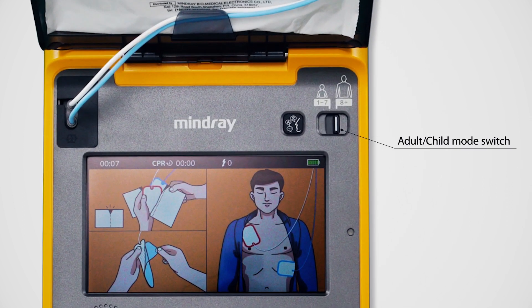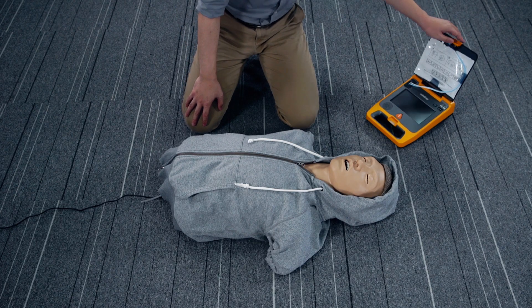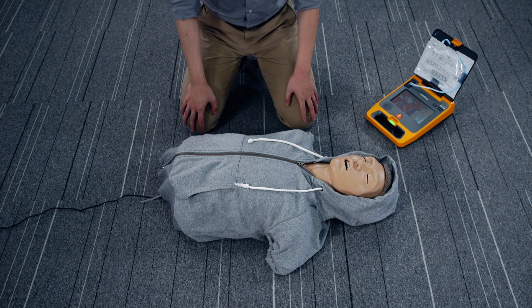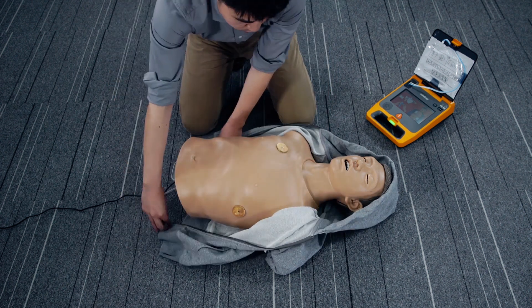Adult Mode English. Powered on. Stay calm. Follow the instructions. Remove clothing from patient's chest. Apply pads as shown on pads.